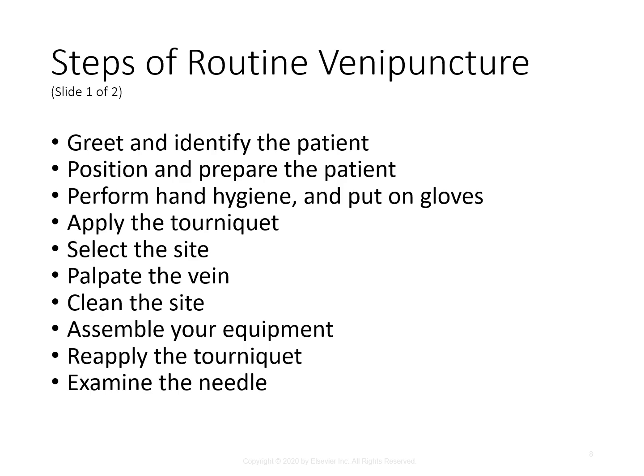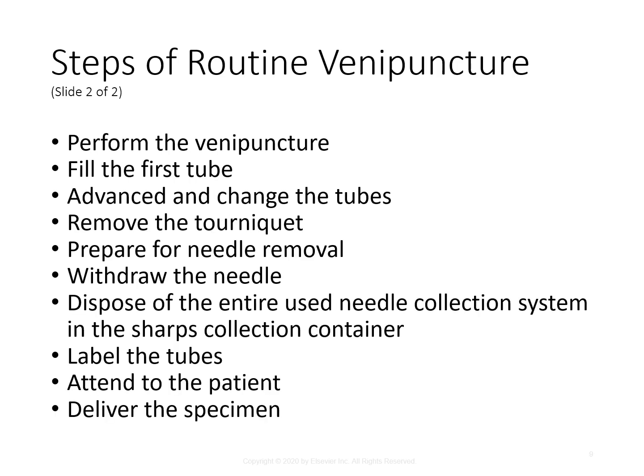Then you're going to position and prepare the patient. You're going to perform hand hygiene and put on gloves. You're going to apply the tourniquet, select the site, palpate the vein, clean the site. You're going to assemble your equipment. You're going to reapply the tourniquet, and then you are going to examine the needle to make sure it looks the way it should. And then you're going to perform the venipuncture. You're going to fill the first tube, advance and change the tubes if needed. You're going to remove that tourniquet, and then you're going to prepare for needle removal.